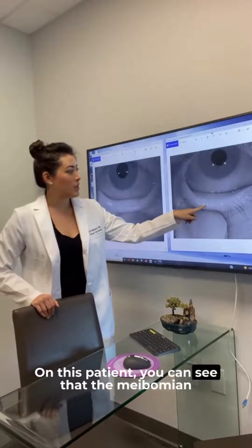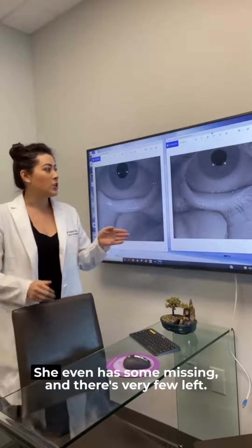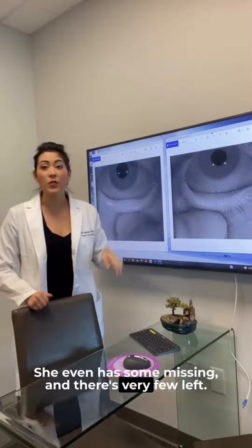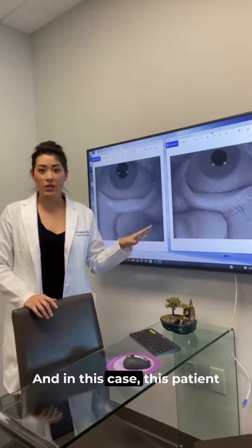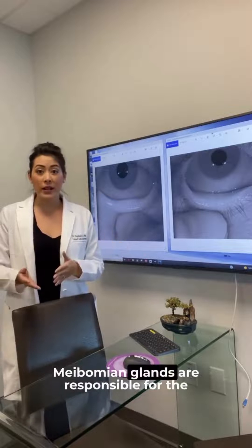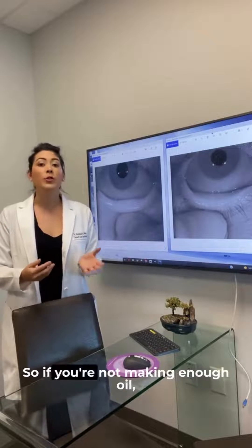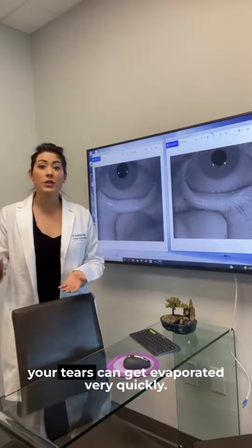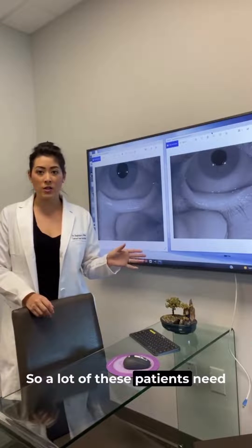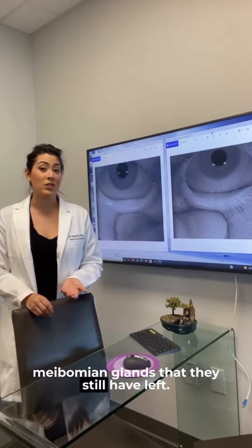On this patient, you can see that the meibomian glands are very short — they're very tiny. She even has some missing, and there are very few left. In this case, this patient probably has something called dry eye. Meibomian glands are responsible for the oil component of the tears, so if you're not making enough oil, your tears can evaporate very quickly. So a lot of these patients need dry eye treatments to help maintain the meibomian glands that they still have left.